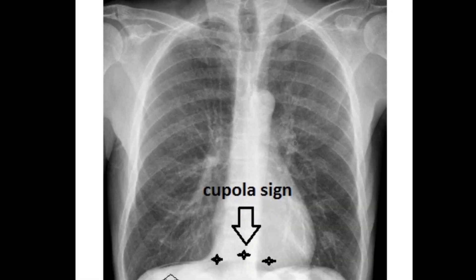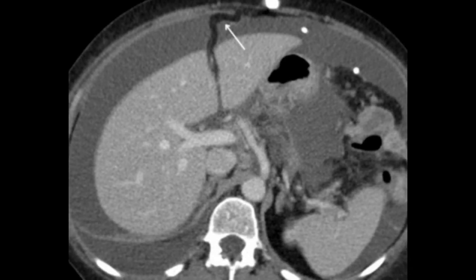On the right upper quadrant, certain signs can be picked for pneumoperitoneum. The cupola sign, appearing like an inverted cup, is indicated by white and black arrows on the chest radiograph. On the right upper abdominal quadrant, the ligamentum teres sign can also be appreciated — the white arrow on the abdominal CT scan indicates this as a confirmatory sign for pneumoperitoneum.